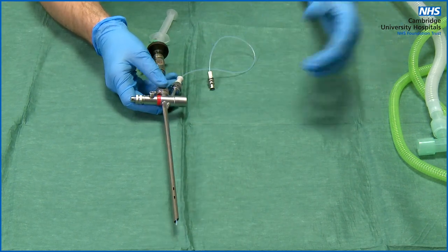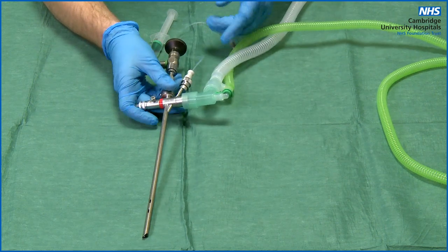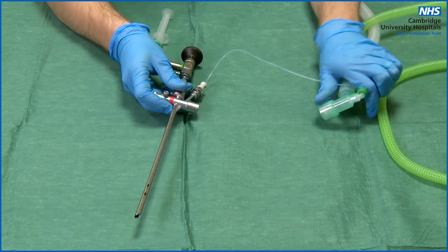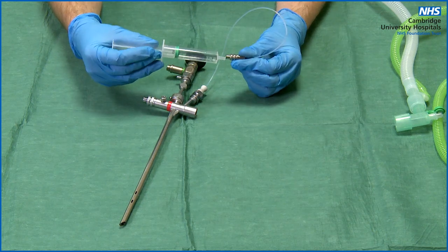The anaesthetic airway circuit is usually connected after the scope has gone into the trachea — simply push it onto the side port. Bear in mind not to connect the suction until it is needed, and to turn it off when not in use, as it will remove the anaesthetic inhalation agents and vital oxygen being delivered by the anaesthetic airway.